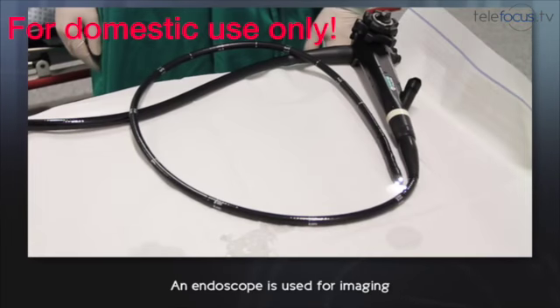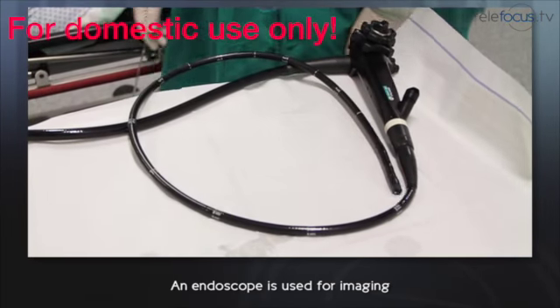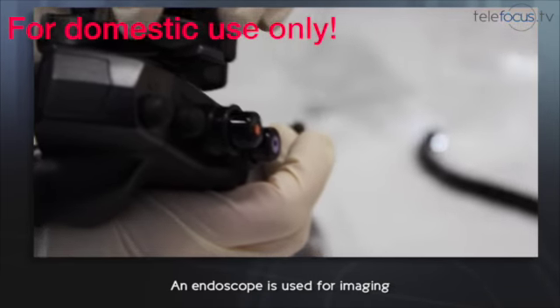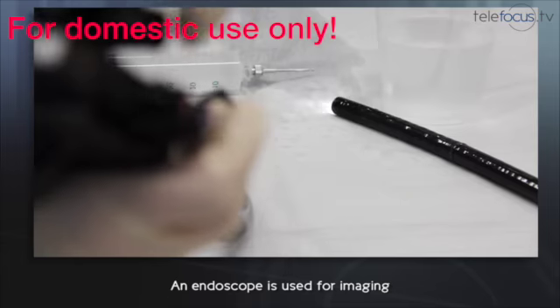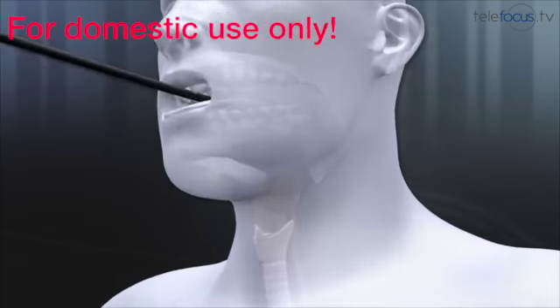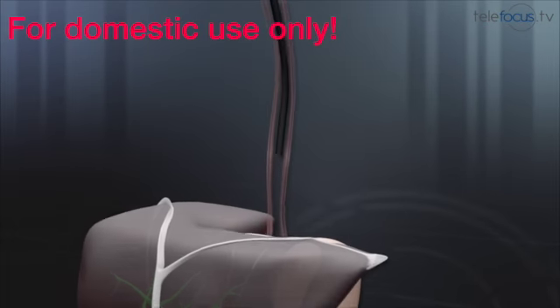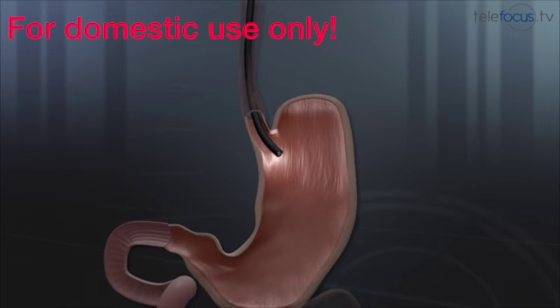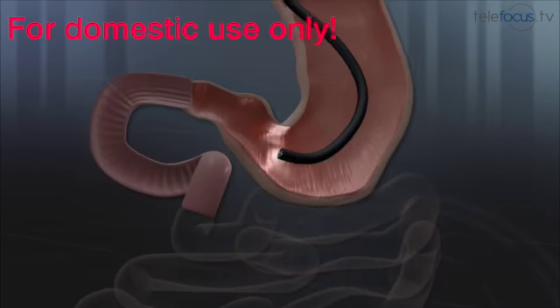The examination is performed by using a thin, flexible, fiber optic endoscope. The instrument has the diameter of a small finger. It is used for the examination of cavities within the body. The esophagus, the stomach, and the first centimeters of the duodenum are examined. A lubricant supports the procedure.